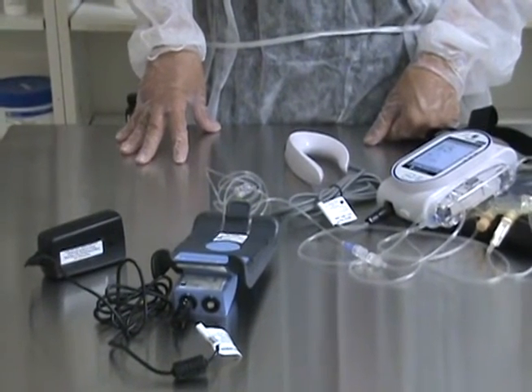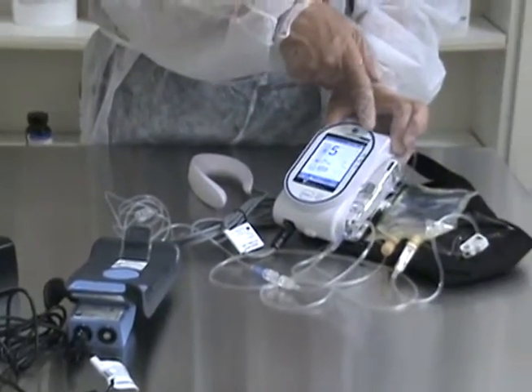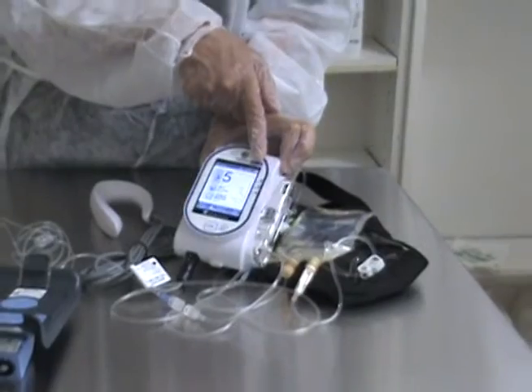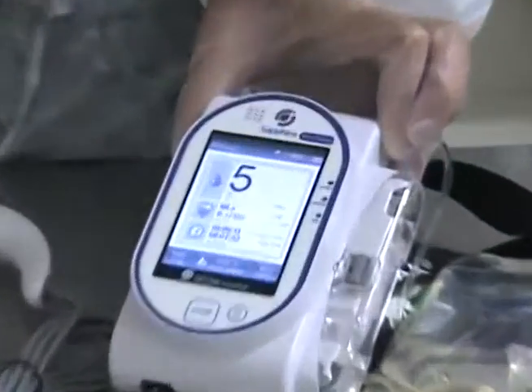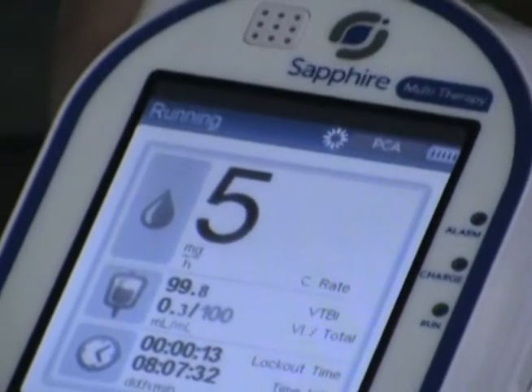It takes about four hours to resume a full charge. You can tell how charged the battery is by the display — there's a line similar to a cell phone indicating the charge level. Four lines indicate a full charge.